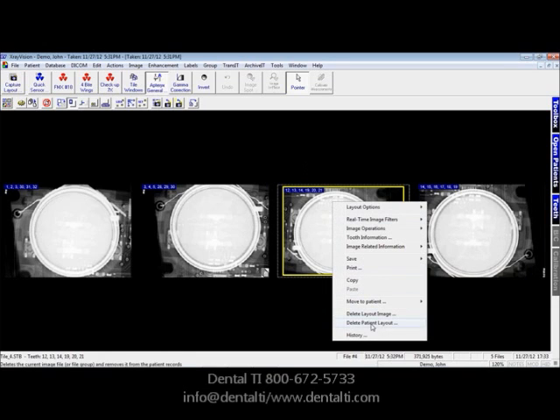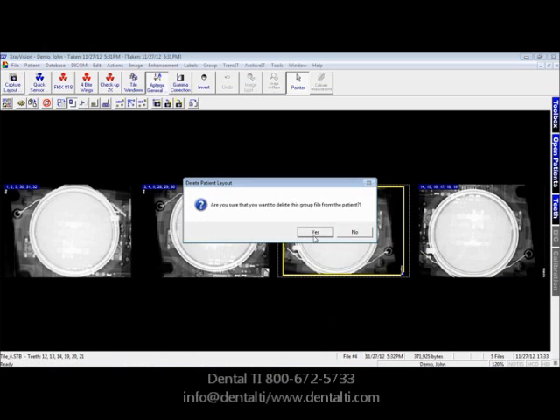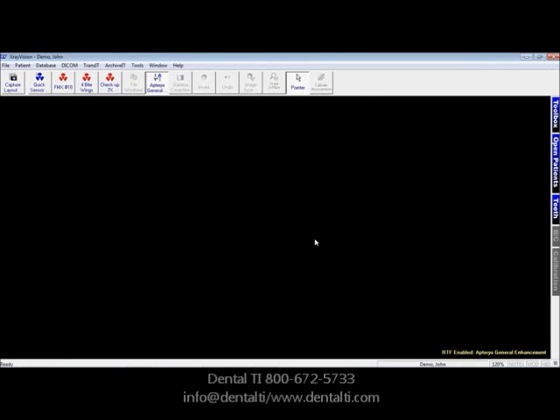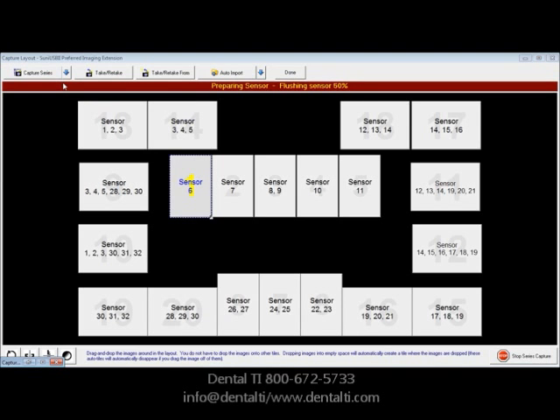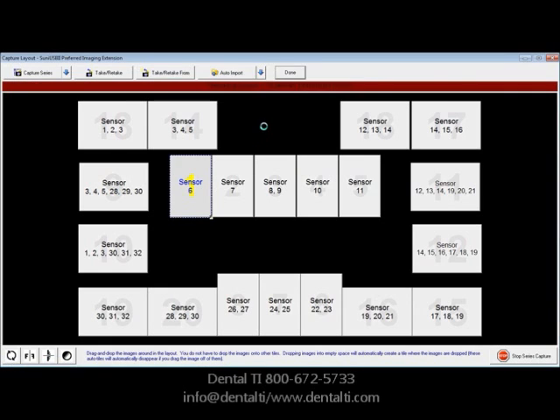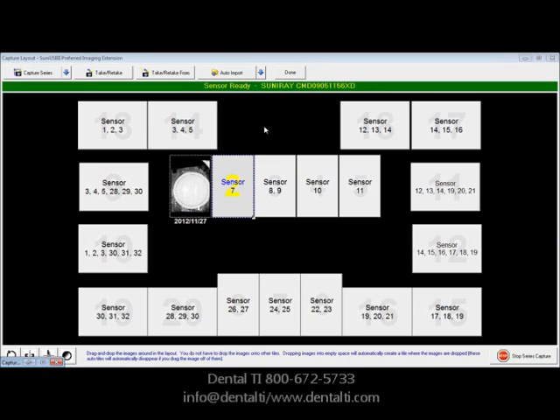We're going to right-click and delete this patient layout. Let's look one more time with the FMX-18. All it is is clicking the one button, and depending upon the order that your layout has been defined for advancing, here we're starting with the anteriors — though you may want to start with the posteriors and we can define that layout for you. The sensor will always advance to the next spot. There it goes to number two. If we did not want to take this full mouth series, we could simply click Stop Series Capture.